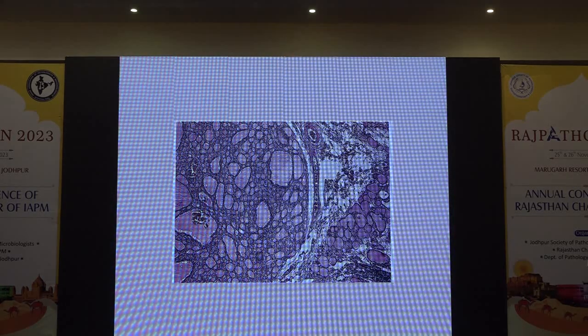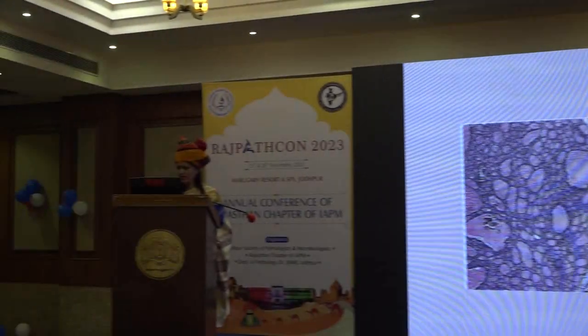These are microscopy, with varying sizes of follicles filled with colloid, but very well circumscribed and separated by the surrounding thyroid. Follicular adenoma, we all know this entity, it is a benign encapsulated mass which is solitary, which is a cold nodule, shows a uniform pattern of follicles, may be macrofollicular, microfollicular, they can be fetal, embryonal or trabecular.